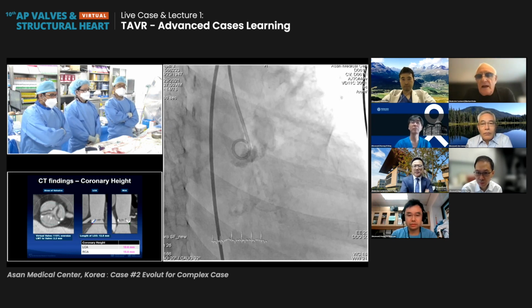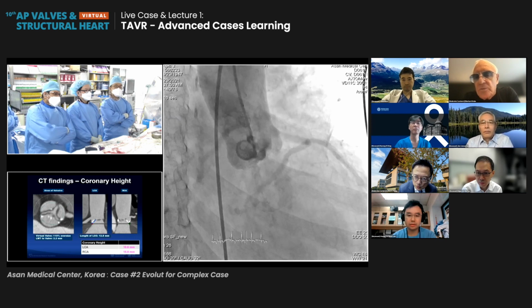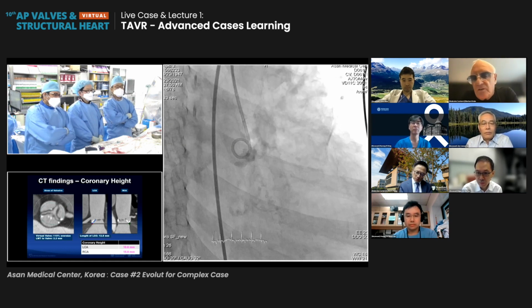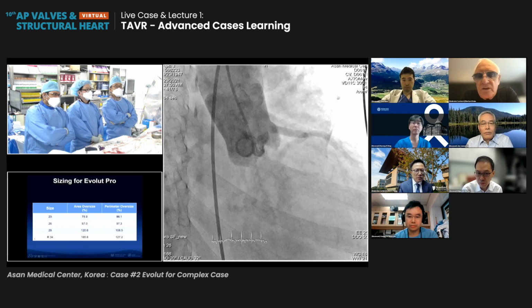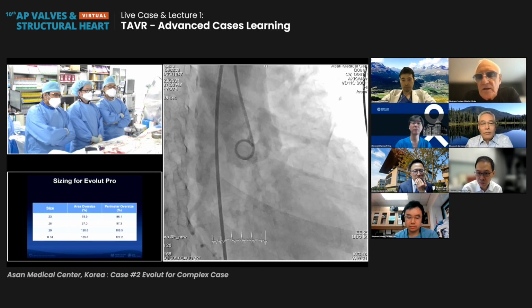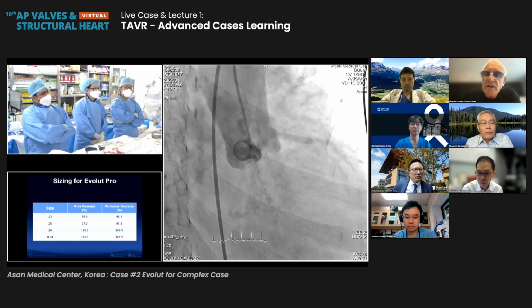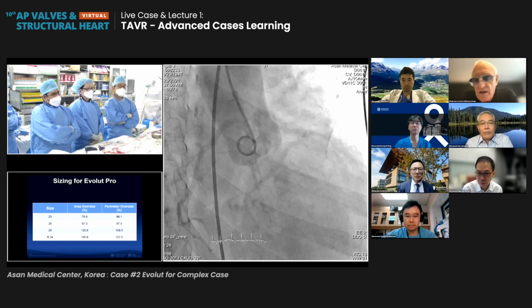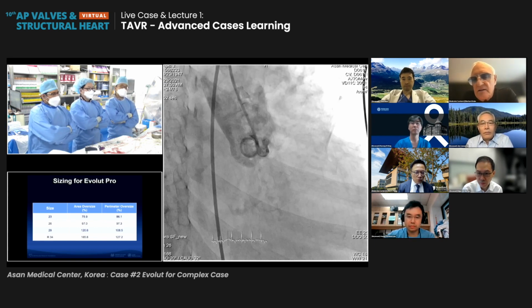So Eberhard? Yeah, I think that's definitely a more challenging case here, not only as far as calcium is concerned, but also the coronaries and the small sinuses, it looks tube-like. The question is whether you use a 34 or 29. Even though you have a low ejection fraction, if you don't want to do protection regardless, I think it would help to place a wire there, or to do ballooning in order to see what the leaflet is doing when you balloon it, as a way of considering going ahead with no protection or no stenting. I think the question is still open.